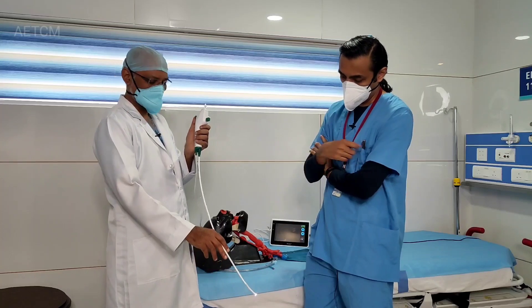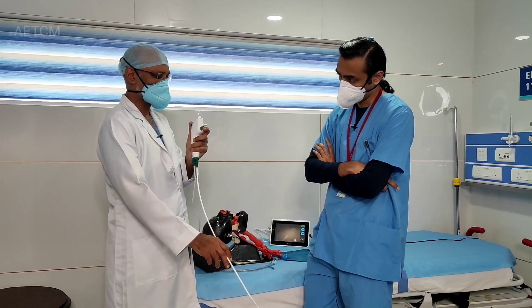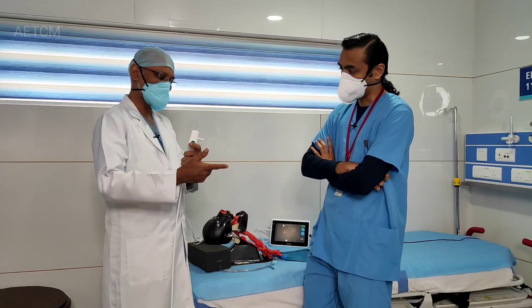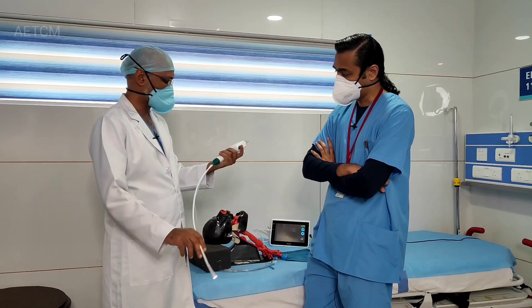So basically the movement is only in two directions. And then you have a small knob here for suction — when you activate it, it does the suction, and the suction tube can be connected here. There is another channel here through which you can do some flushing in case you need to clear the channel.